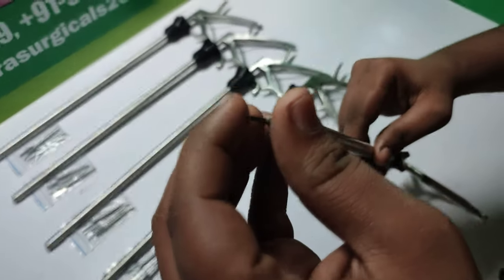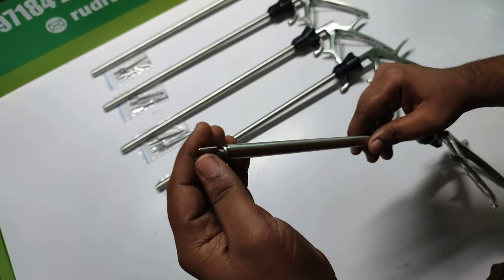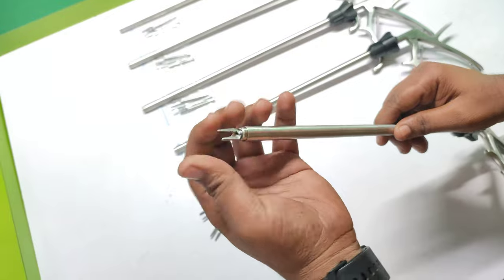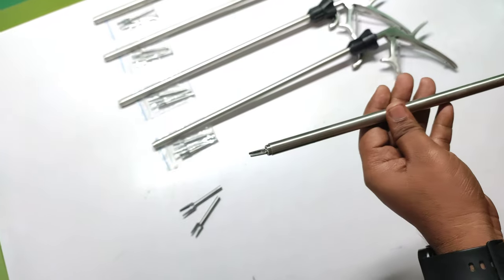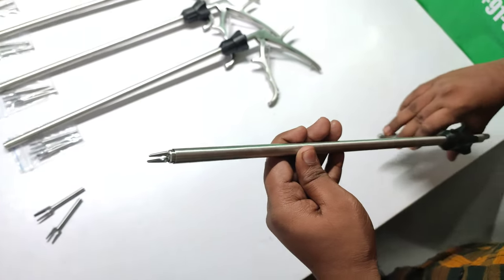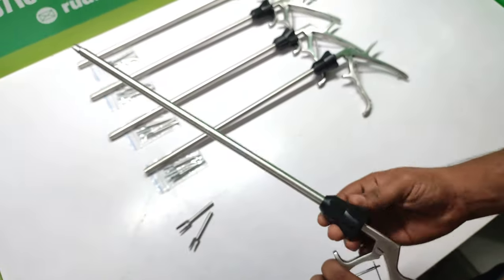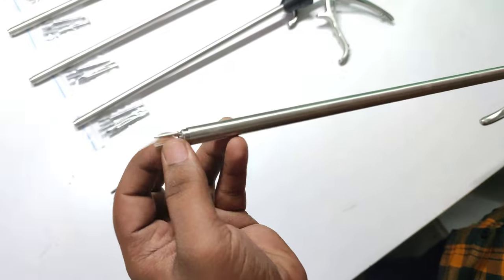This is the small jaw. We have to rotate it anticlockwise and clockwise to remove and attach the jaw. Here we have attached it, and here we show how to remove it.